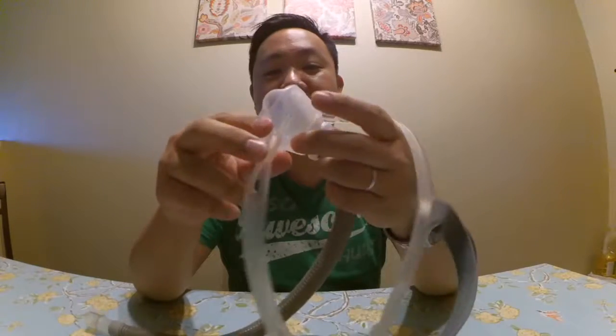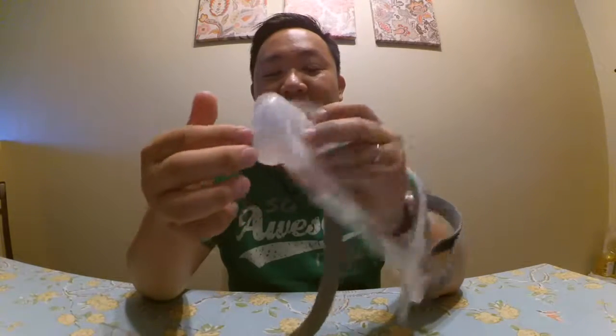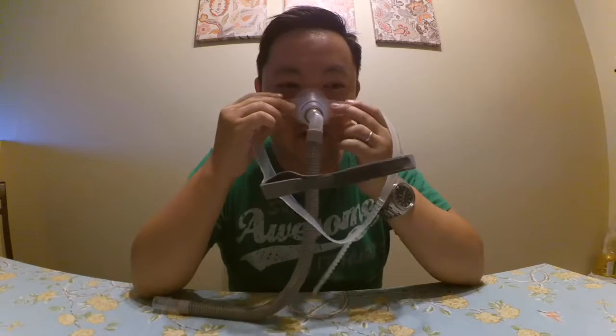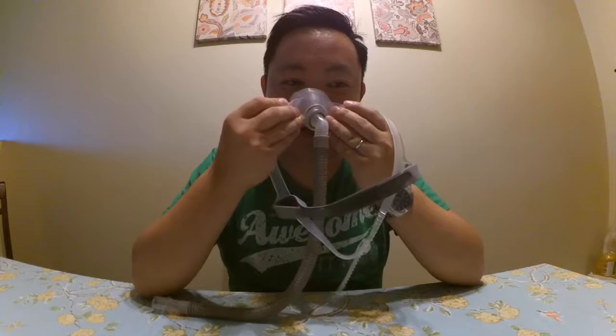Since my nose isn't that tall, I have a hard time preventing leaks with some masks, but with this one it's easy because the silicone is soft and when air fills it up it provides a good seal. I really like this mask rather than those hard-shaped ones where even though it makes a seal, air still goes out on top of my nose because I don't have a taller bridge.